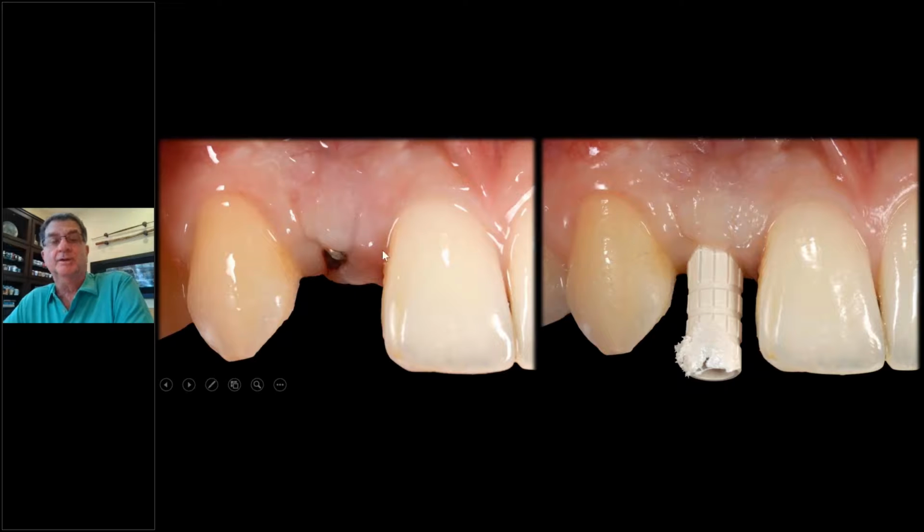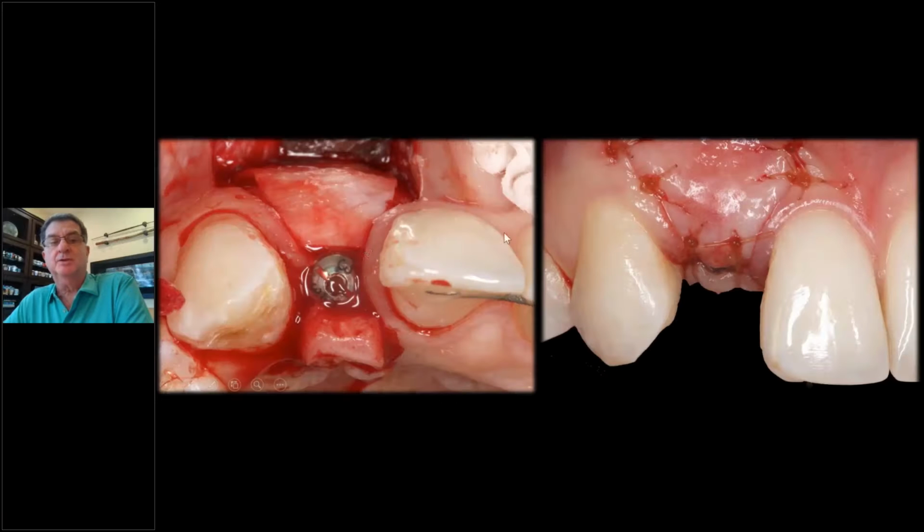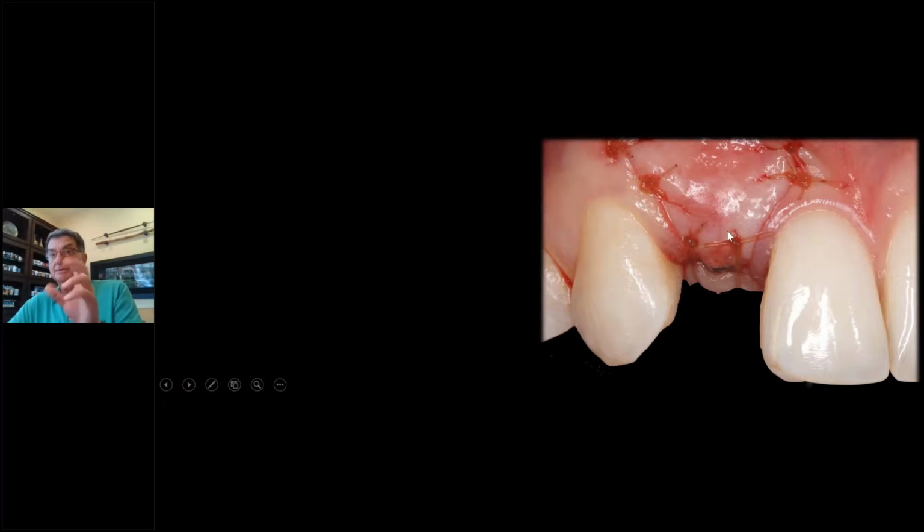And so we put on a straight healing abutment, that's the key. We go back for a second. When you do this, put on the straightest healing abutment you have. Don't put a temporary on it, or else it'll push this tissue out. Then this keloid that he calls it, it's really not a keloid, the groove gets bigger. So the key here is when you have a healed ridge, do not put a full temporary on that tooth. Put a straight healing abutment for whatever company you're using. That way you can get good closure here and minimize the opening in this groove. Otherwise, you can suture as much as you want, but if you push that tissue out too far, it won't adapt.